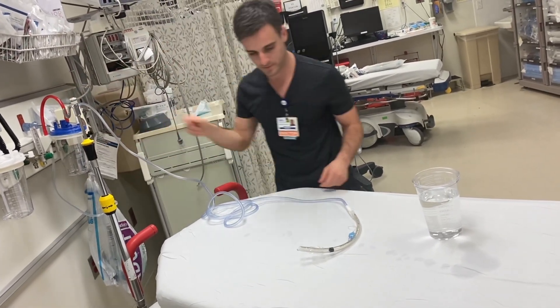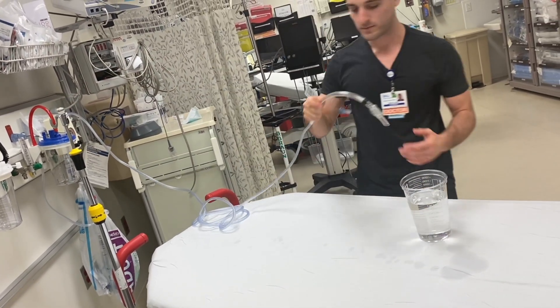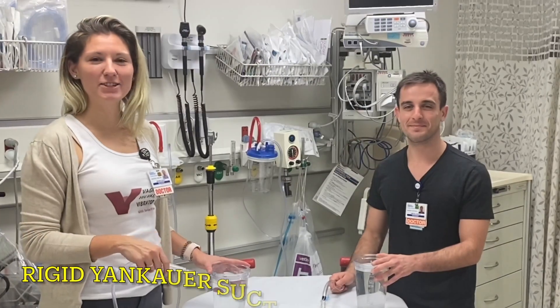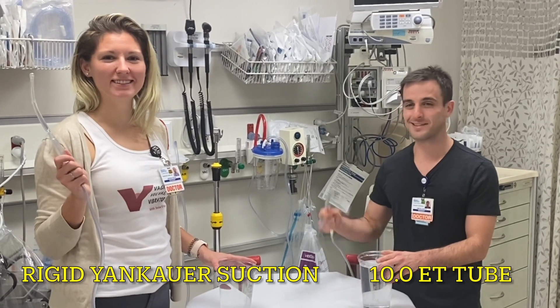Turn on the suction. And so to compare, we have a Yankauer and a size 10 ET tube.